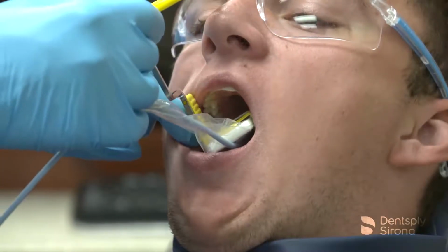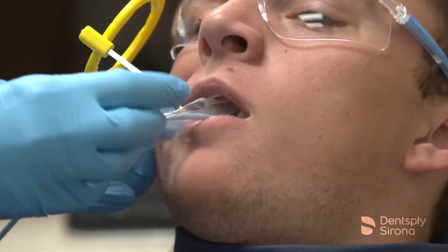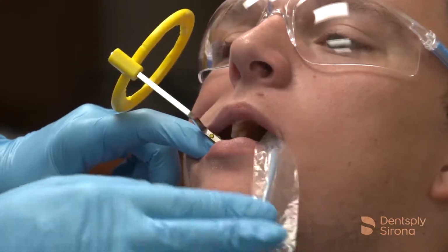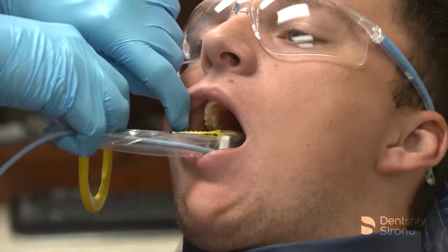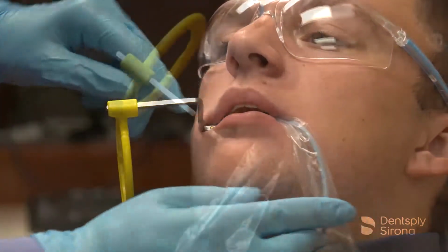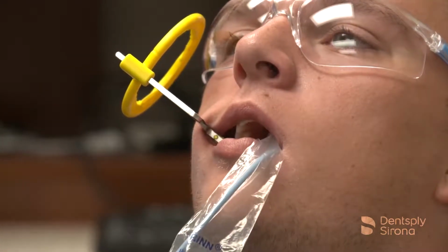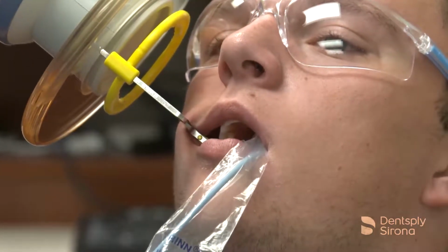To obtain images of the maxillary or mandibular posterior teeth, guide the image receptor into the patient's mouth, allowing the sensor to find its way comfortably. Center the sensor behind the tooth being captured and rest the bite block on the tooth's occlusal surface. Instruct the patient to close slowly, align the handheld portable X-ray device, and capture the image.